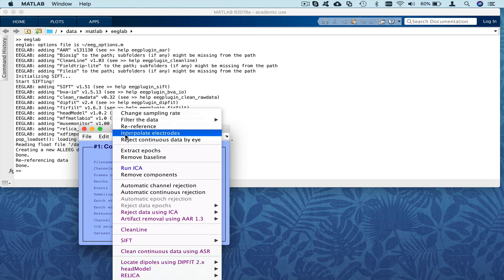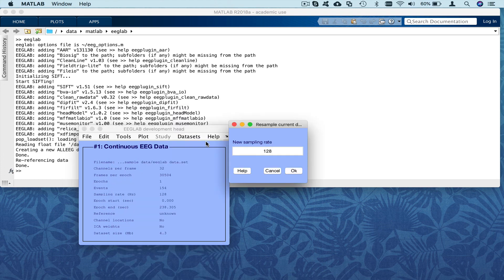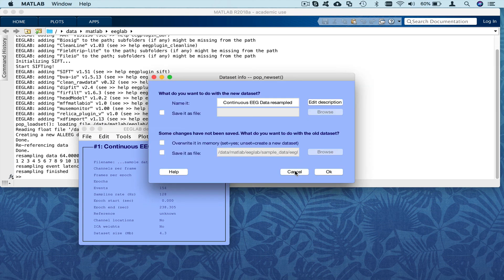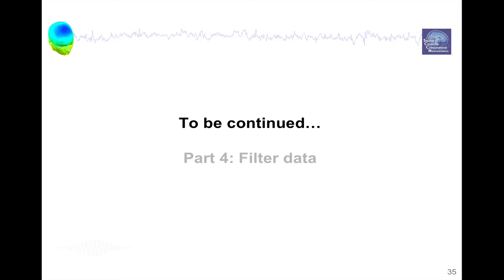Then I'm going to resample the data: Tools > Change Sampling Rate. I already have 128 Hz here, which is relatively low — we don't want the sample dataset to be too large for download. In practice I wouldn't downsample further, but just for illustration I'm going to resample to 64 Hz. This will apply a low-pass filter below 32 Hz before changing the sampling rate. Again, you can choose what to do with the dataset — I'll just overwrite it. In the next presentation we will see how to filter data.